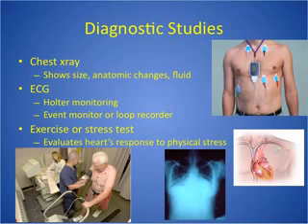The thing you should know about ECG is it is the quickest, most accurate way to show location of an MI. This is a common thing to test on, and a lot of times students want to jump to cardiac cath, but think about that. Cardiac cath is invasive. You got to be in a place where you have that facility. Not every facility can do cardiac caths. So ECG is much faster and safer, quickest, most accurate way to show location of an MI.